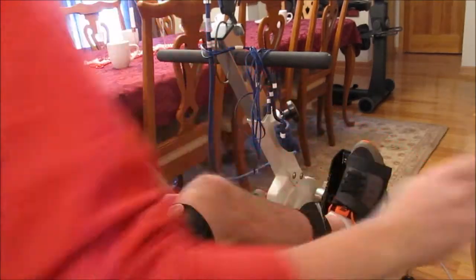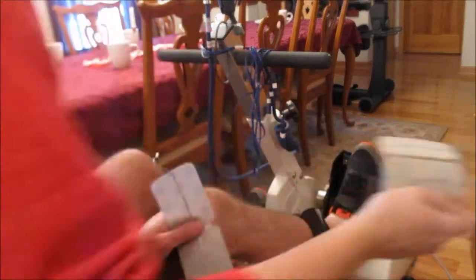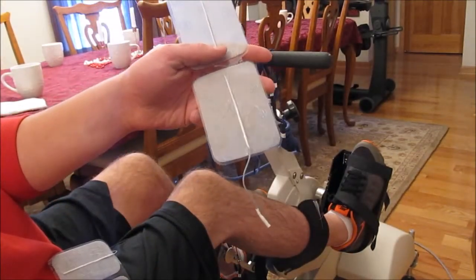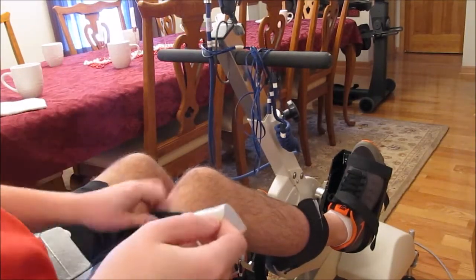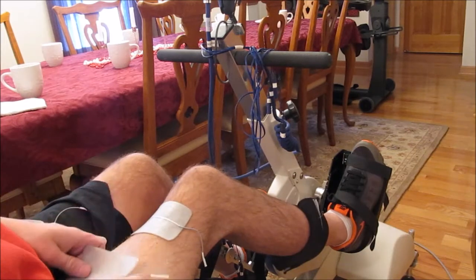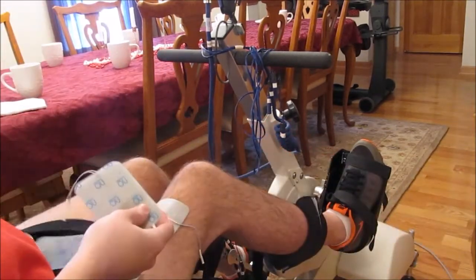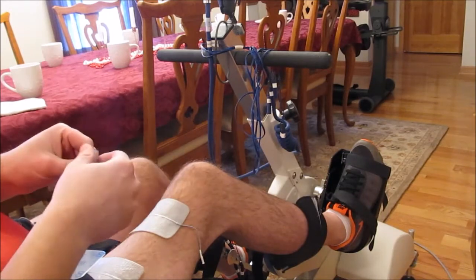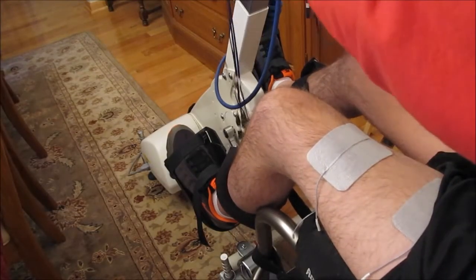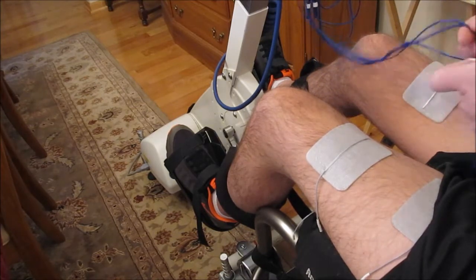It's time to put the stimulation pads on — I have larger ones and smaller ones. The smaller ones go on my glutes, and the larger ones go on my quads and my hamstrings. I put two stimulation pads on each muscle group, and then these stimulation pads will get my muscles to contract. It's really good for preventing the muscles from atrophying. I have to attach these cords from the bike to these pads to get the electricity to shock and contract the muscles.